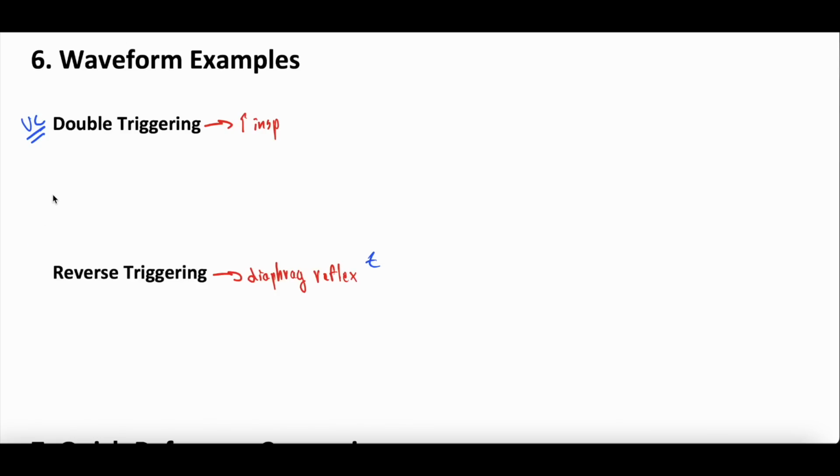The pressure scalar normally looks something like this. So it's pressure and time. And this is your PEEP, where it starts. We've had a bunch of videos on scalars, so check those videos and episodes, both podcasts and YouTube, on the playlist. But this is your PEEP. It's not at zero pressure. And then your pressure goes up, comes back down, right? Goes up, comes back down.